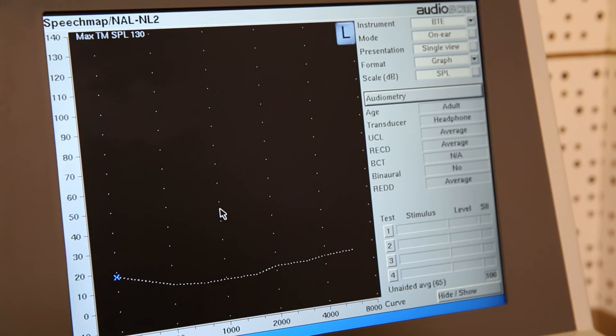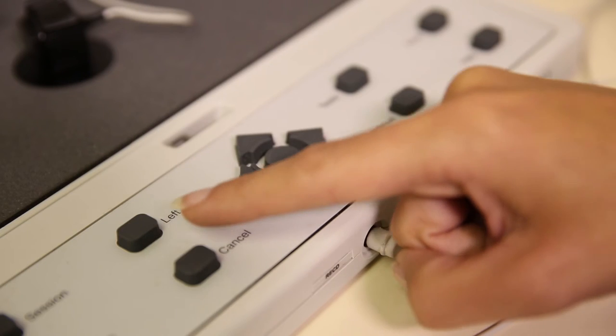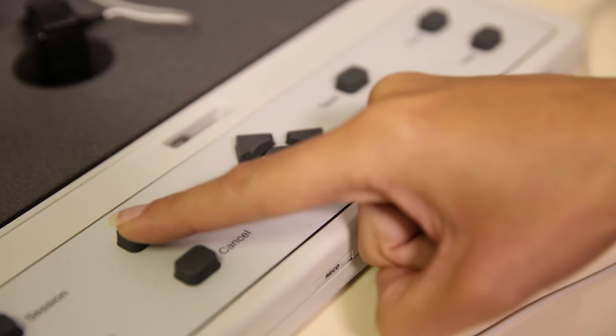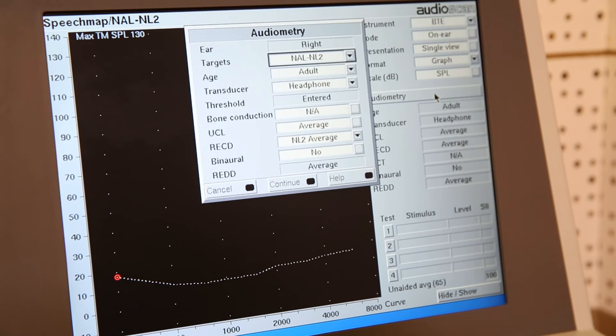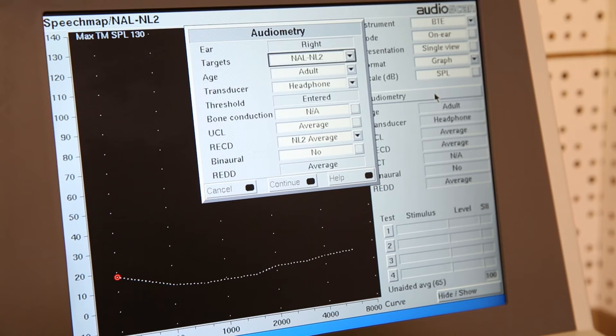When you are in the speech mapping test page, you will select the correct ear and then go to audiometry. This will allow you to set up the target that you will be using.